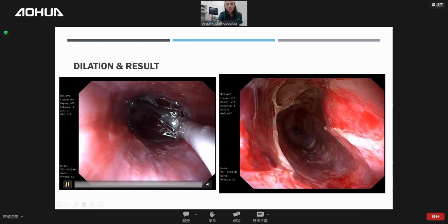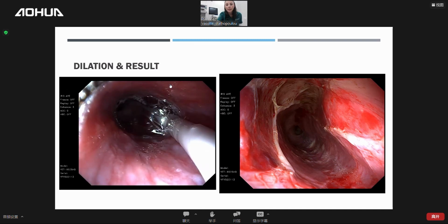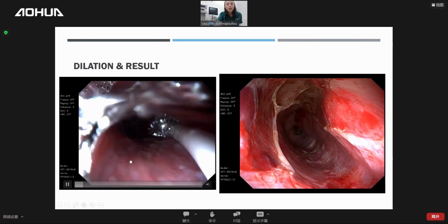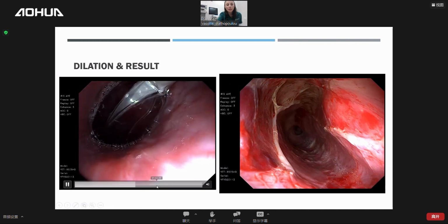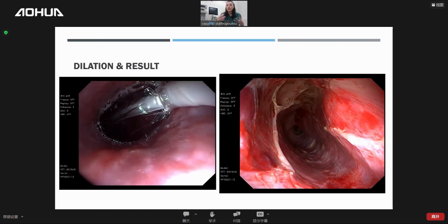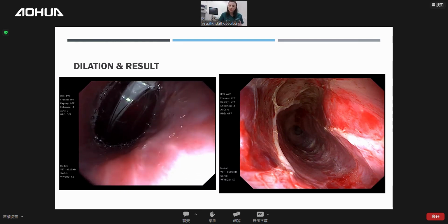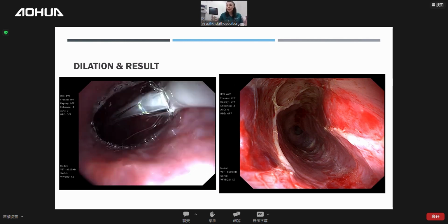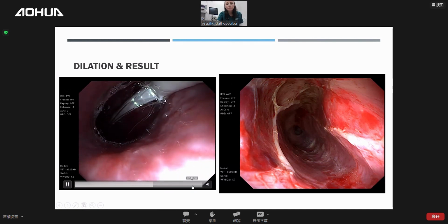And this was the dilation procedure. This is shown better than in the cat. So we dilate the balloon, and we wait there, dilated, dilated, dilated. We just stay. You see for how many minutes? I try to gradually over-distend the balloon. Then the next time I use bigger balloons, bigger in diameter, so that we can keep a very safe diameter for the animal, in order to be functional, in order to be able to eat. Okay. And then let's see what we have caused.